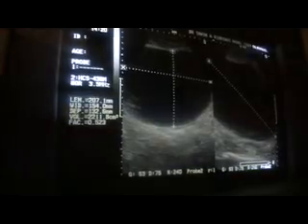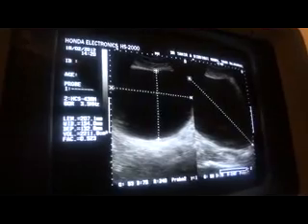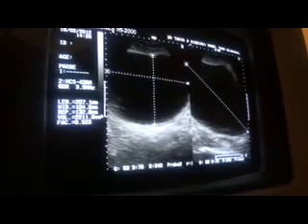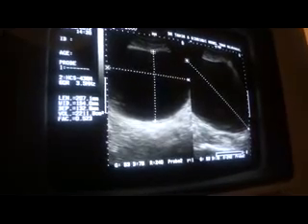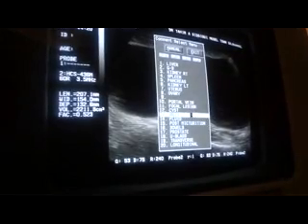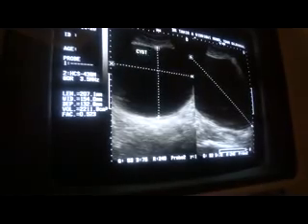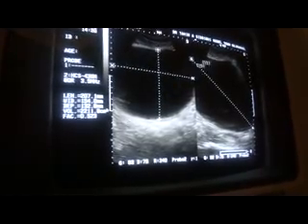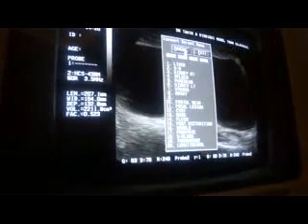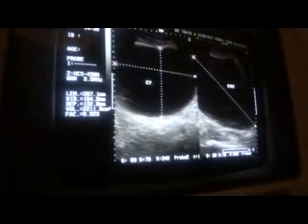Is something around 2.2 liters, even more than that. It will be more than that. 2.2 liters is what we are getting by ultrasound. However, when surgical intervention is done, the size will be more than we are getting in this ultrasound study, and its volume will also be more.